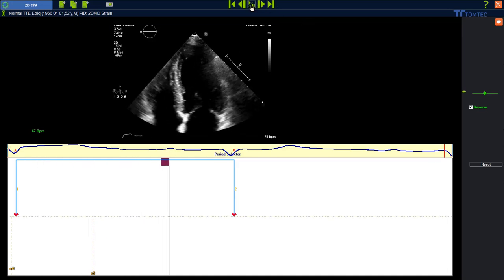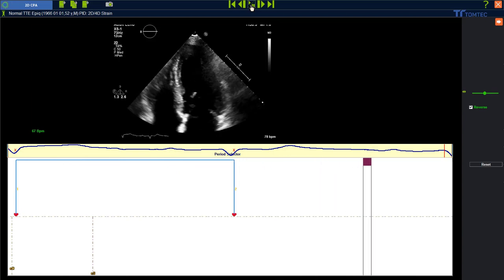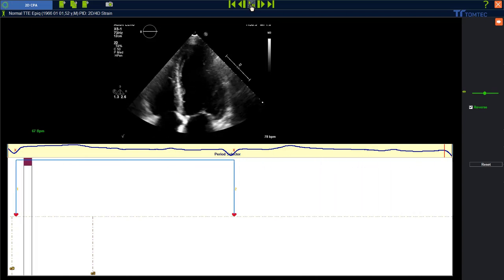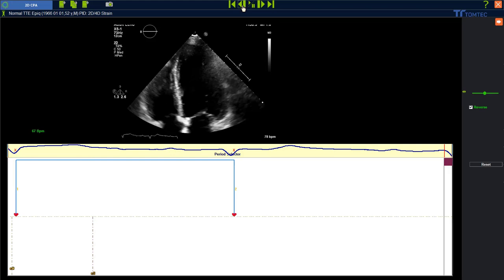First of all, let's play the loop using the toolbar and see how many beats we have. Stop the loop again and then use the frame by frame button. The last R wave is missing.